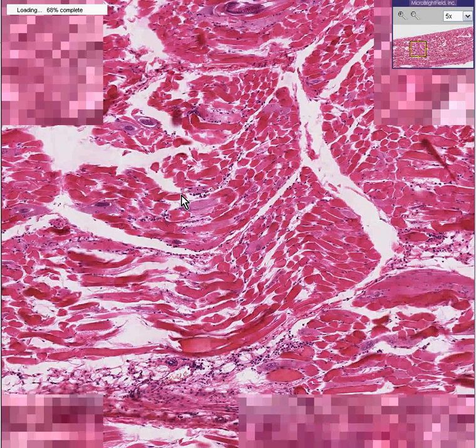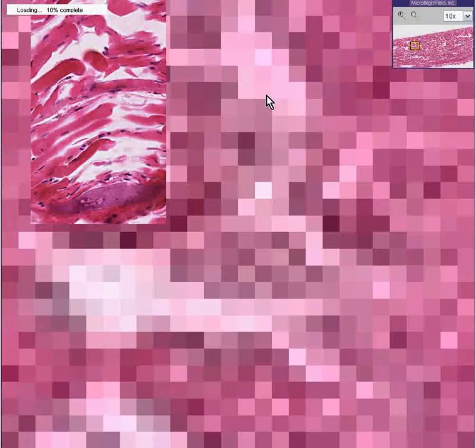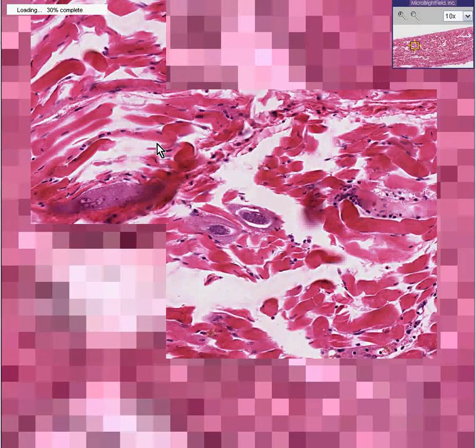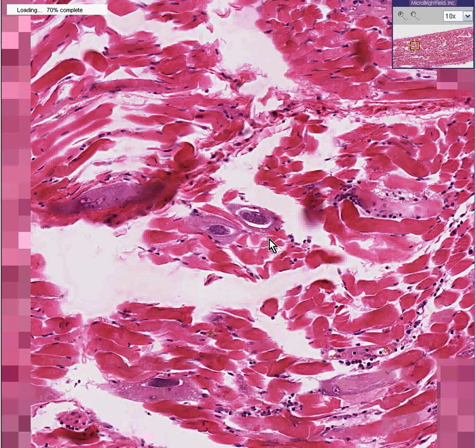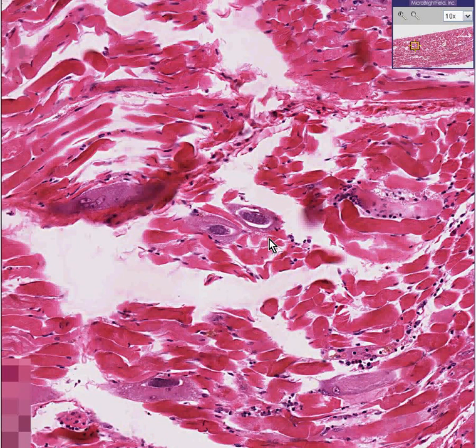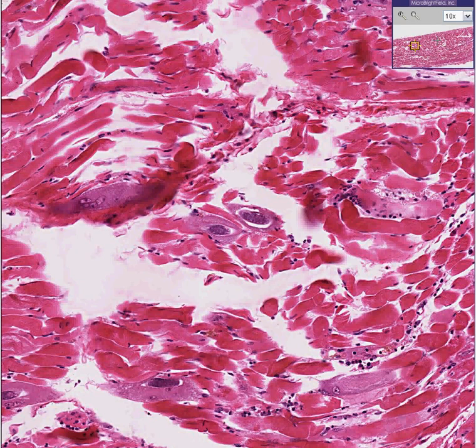Also notice that whatever these things are, they don't have much of an inflammatory reaction around them. It's almost like they were just put there and there's no inflammation. There are scattered inflammatory cells every now and then, but many, if not most, of these little structures look like they are just there all by themselves.